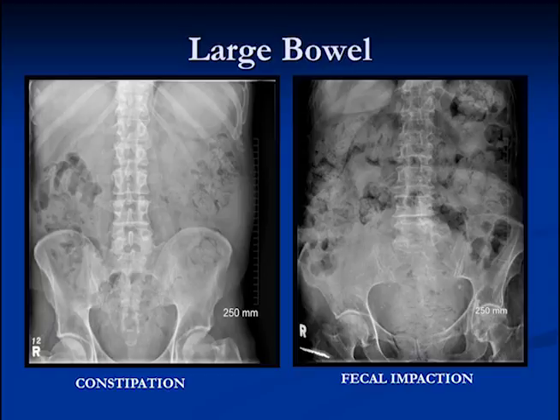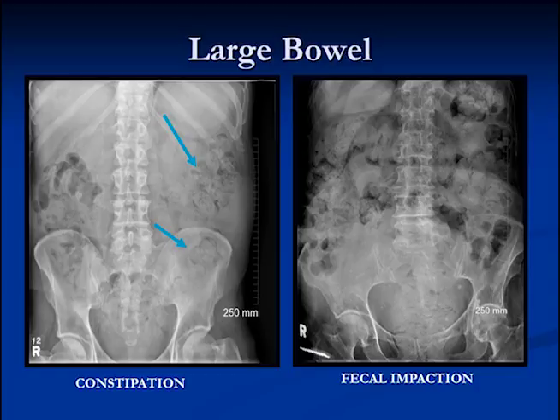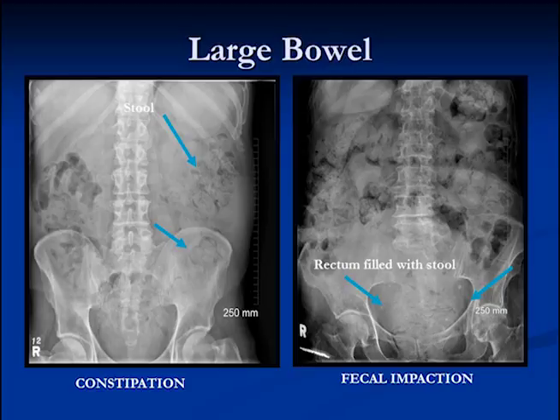Often when we look at plain films of the abdomen, we're going to see fecal material. On people with constipation, there's usually more stool than there should be — you can see the black part incorporated within the white part like little bubbles — this is stool or fecal material, and this patient is probably constipated. When someone is fecally impacted, they have stool throughout their large bowel, and in particular in their rectum. Here you can see the rectum is greatly distended with amorphous material that has air within it — this is fecal impaction.